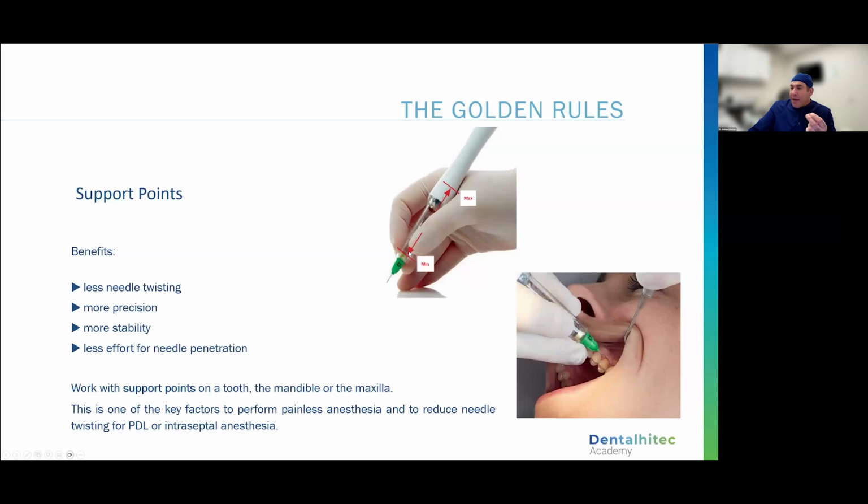So you're going to hold this like a pen. That's the first step. If you hold too close to the base of the unit, this becomes a lever. And as you give pressure, you're going to tilt your hand. It's going to happen. So first and foremost, pen grip as close as I can to that junction.